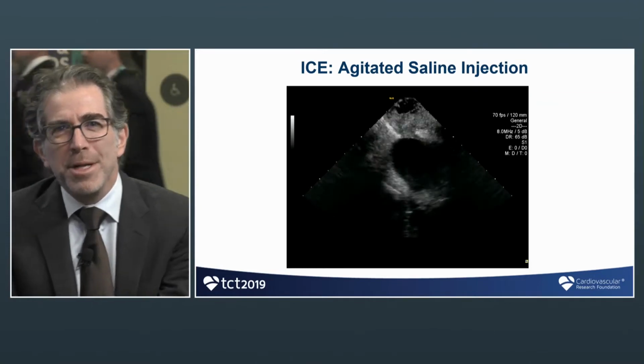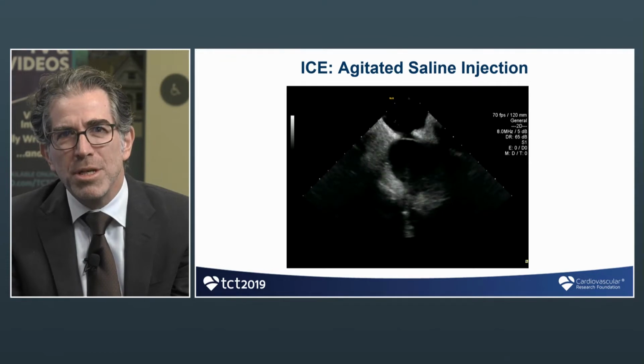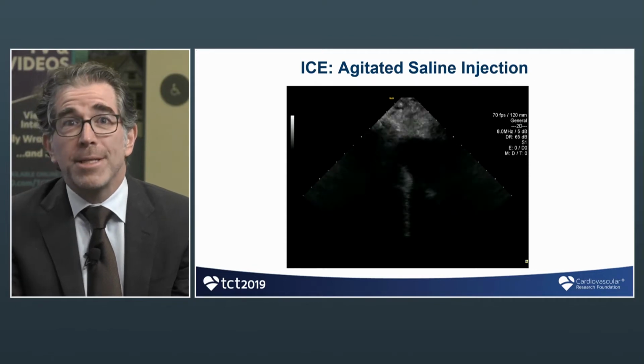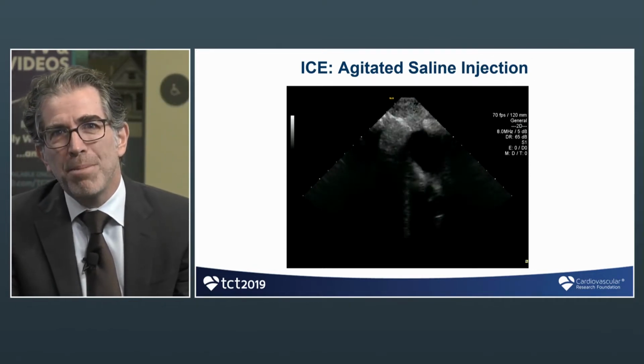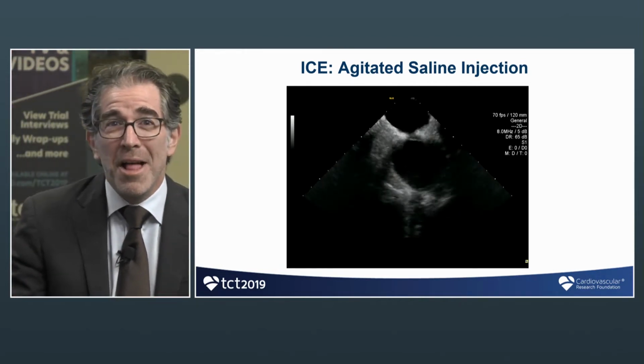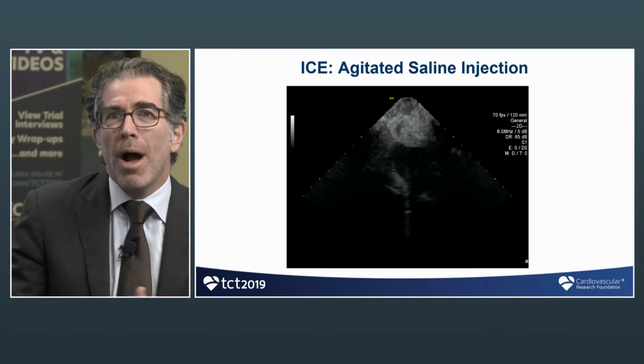I don't want to get too sidetracked here, but we can talk a little bit about size of shunt and indication for closure. You mentioned the early trials, it seemed that an aneurysmal septum did confer benefit, probably because that goes along with a larger shunt. With a shunt. I'm often surprised when you do intracardiac echo, you have patients who have a small shunt on transthoracic or TEE, and then you do the ICE and it's a huge shunt. Yeah, so I think that's a great point because your referrals, many times they mistakenly say, well, we can't find any other source for the embolism, and there's a small PFO, which is probably insignificant. I think the things you can say for certain are that if there's a lot of bubbles, if it really opens up, it's large. But if there's only a few bubbles, you don't really know if it's large or small.